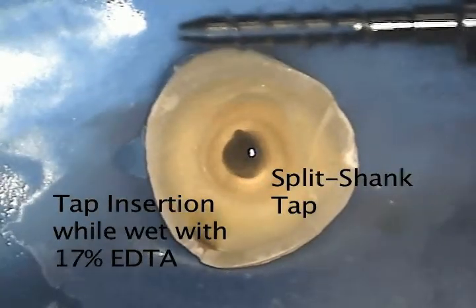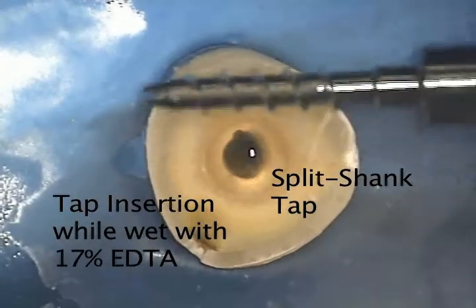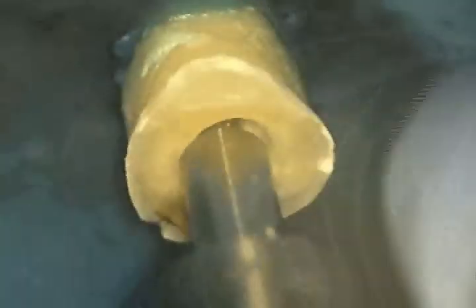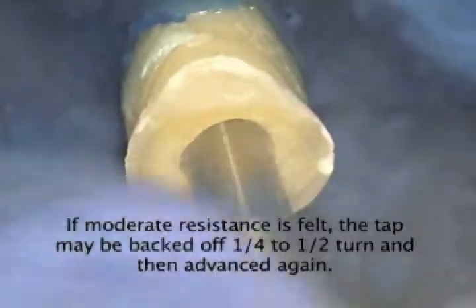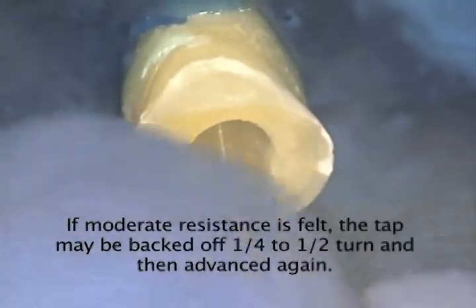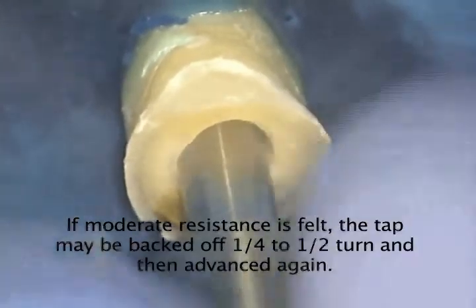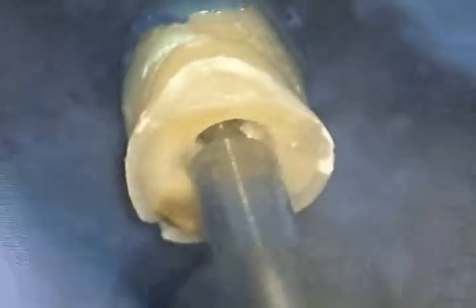With the canal still wet with 17% EDTA, we tap the canal walls to make the grooves for the threads of the fiber post. The threads of the FlexiFlange fiber post add a level of macro-retention that dramatically increases the overall clinical retention of the post in the root. The split tap is threaded into the root until the shoulder of the tap seats in the bottom of the preparation. If resistance is met during tapping, the tap can be backed off a quarter to a half a turn, which will remove the debris into the split and make completion of the tapping procedure go more easily.